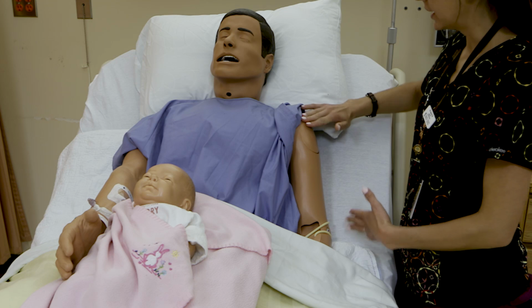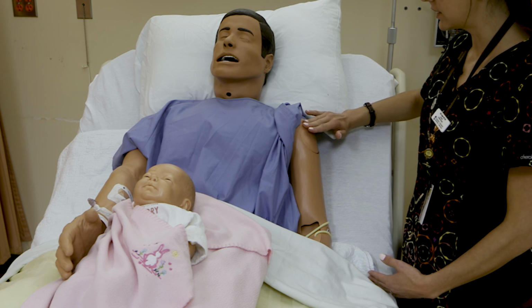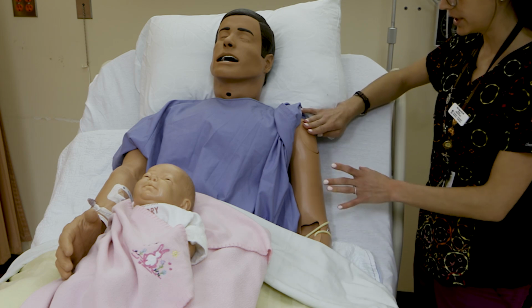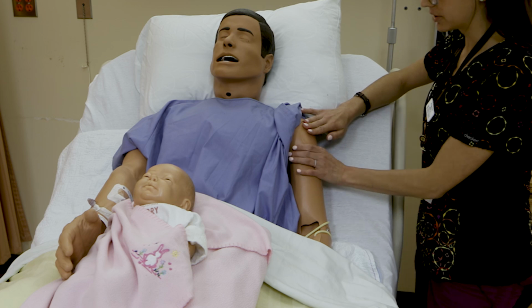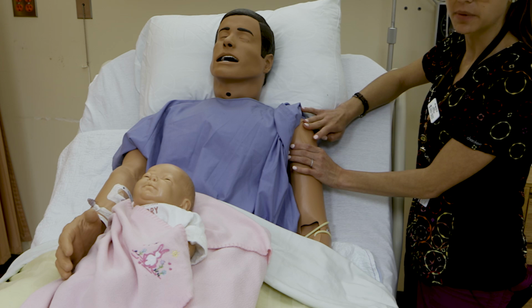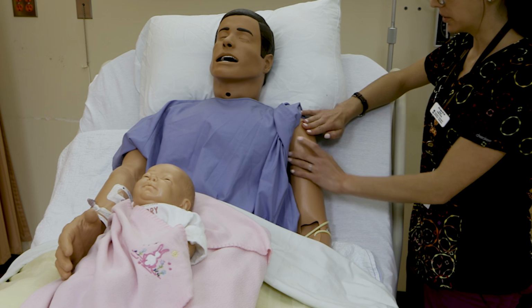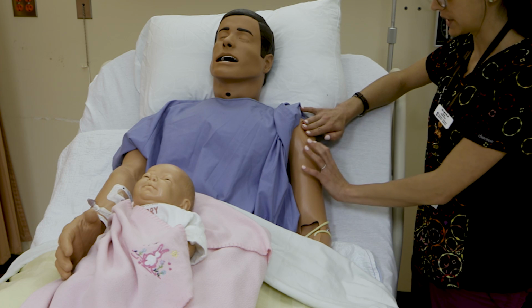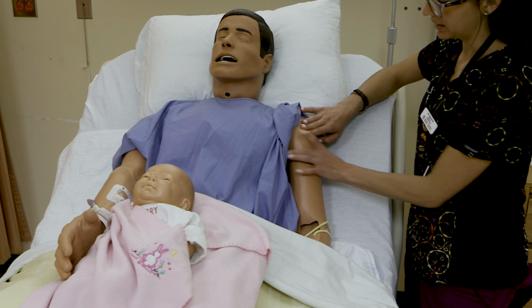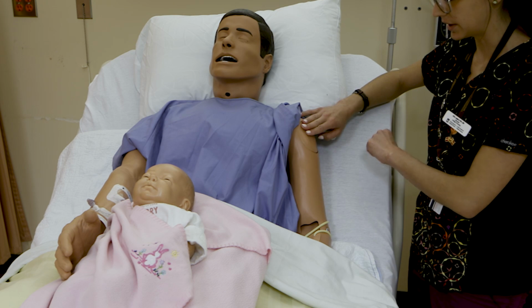Jake's isn't super obvious, but this is roughly where it would be, and you can usually roll your finger over that. So you want to find that acromion process and then go about 3 to 4 finger widths down. Typically it's about 3, and then sometimes you're told to line it up with the axilla too. So you're going to go right in that in-between spot, where the muscle will be. So this one's pretty straightforward: acromion process, about 3 fingers down, and then you go right beneath those fingers within the line of the axilla. You do have quite a bit of wiggle room in there, but pretty much directly there is where you'll want to go.